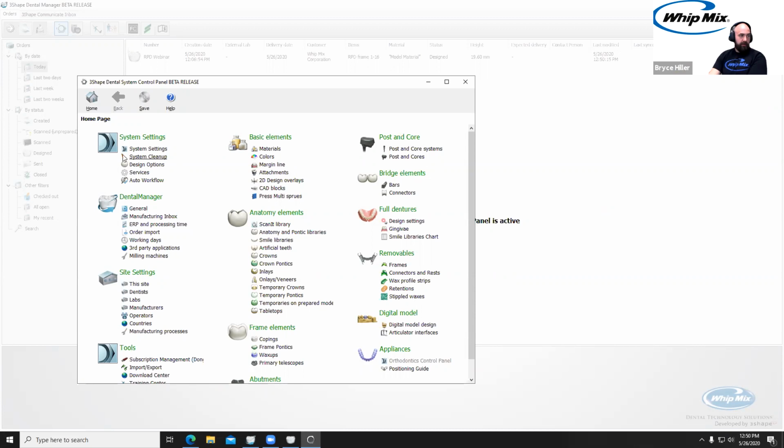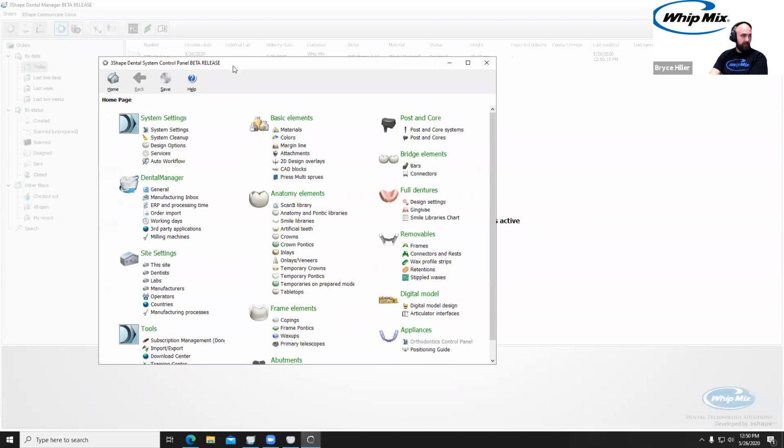We did get another question in regards to the curing units, the auto flash. You want to know where you can get the replacement trays? You can get that directly through our customer service department. If you just call 1-800-626-5651, extension 2451. The item number is 71233 for the actual tray that goes in the bottom of that curing unit. Beyond that, we haven't had any other questions come through.